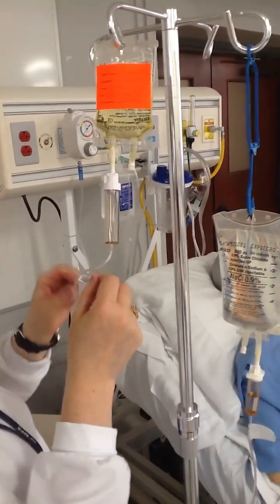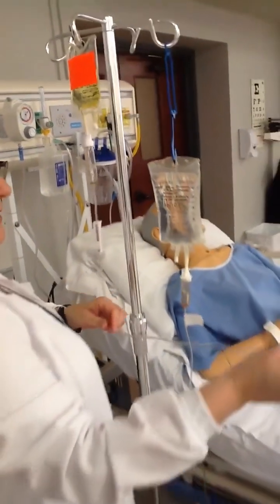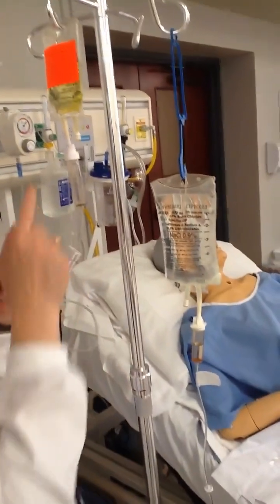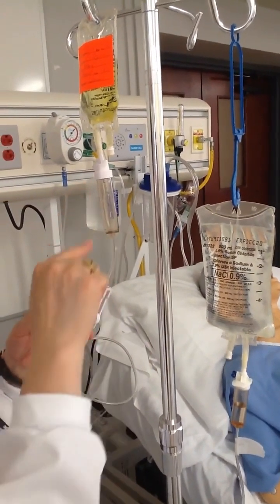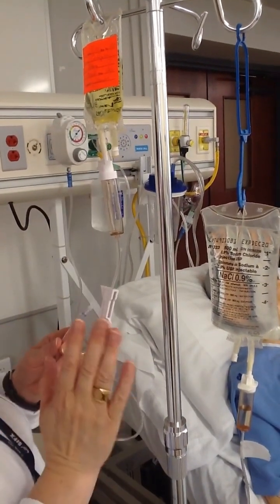So once you have that all spiked, now we have to prime it. And so I'm glad the camera's nice and close. You can stay right up here, Mr. Cameraman, if you would please. First thing that I'm going to do before I prime, and priming means we're going to push all of the air out of the tubing with fluid. So because there's medication in here, we don't want to waste a drop.